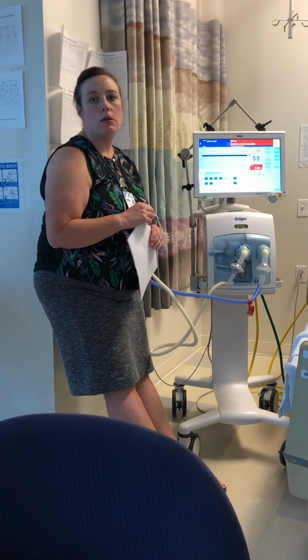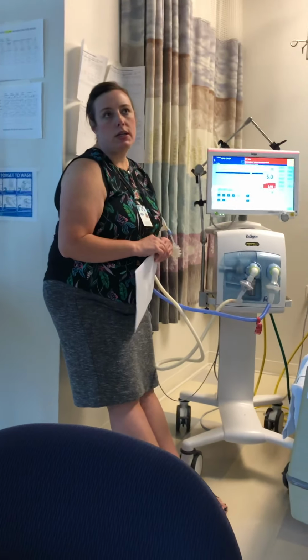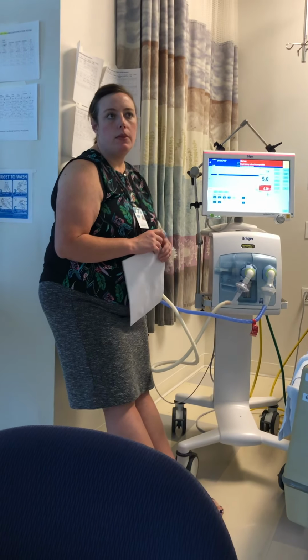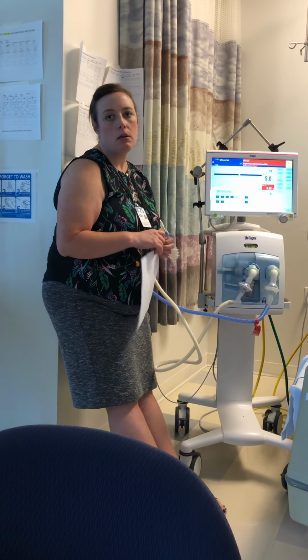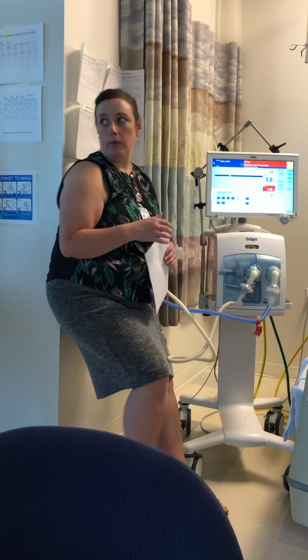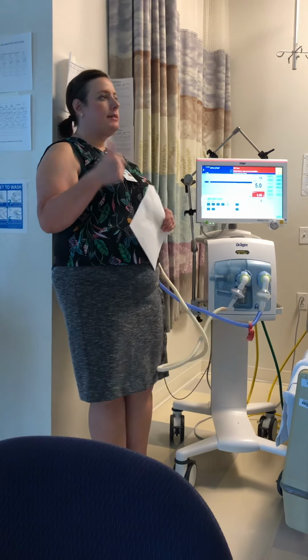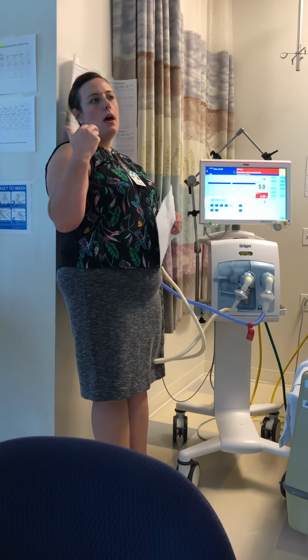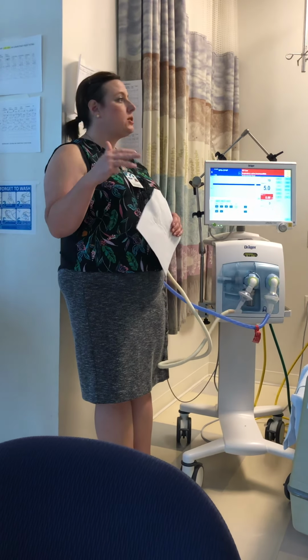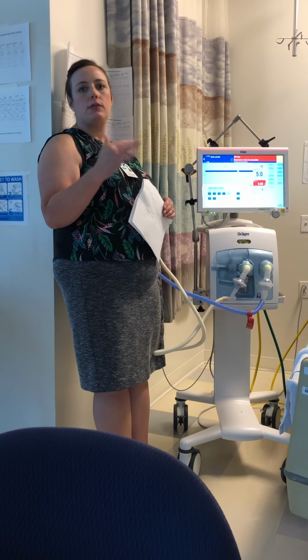How do you know if they're over distended by looking at the X-ray? Do they look super huge? So there's a normal expansion to the rib, and you would actually count the ribs. Okay, so we're using SATs, color, work of breathing, chest x-ray, breath sounds, all to identify if these are the appropriate settings for our patient.